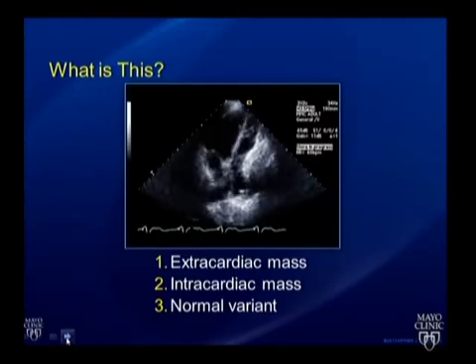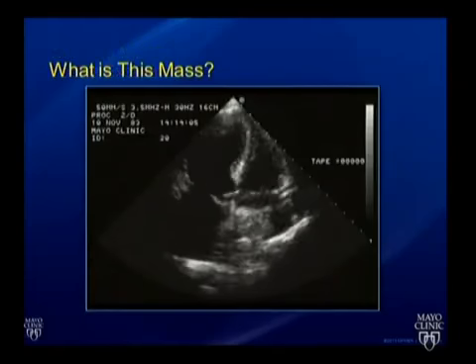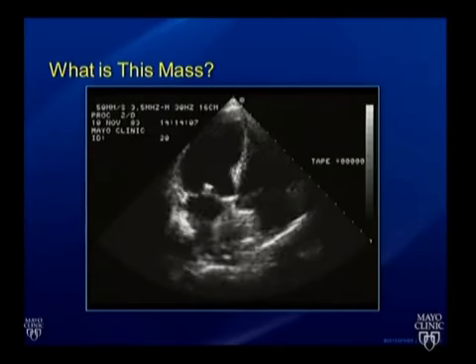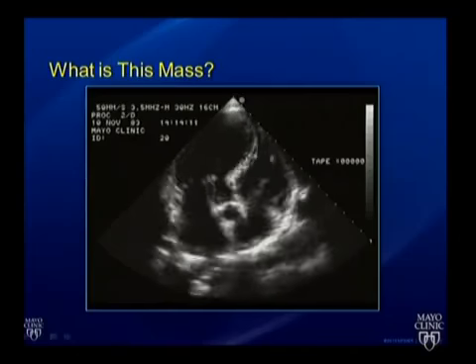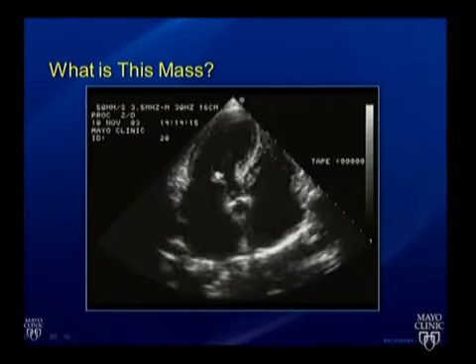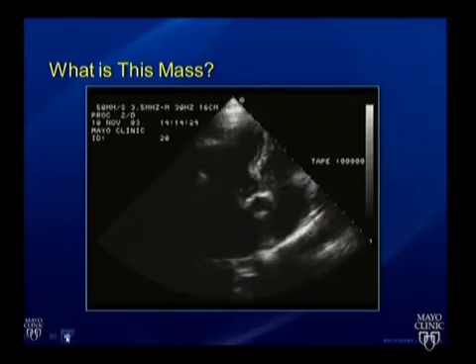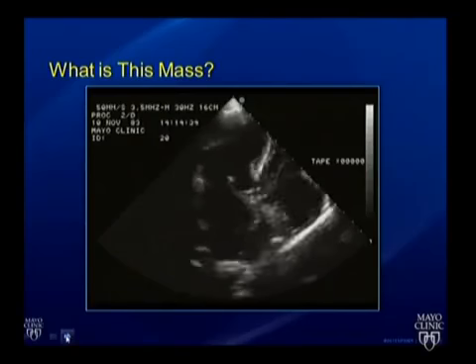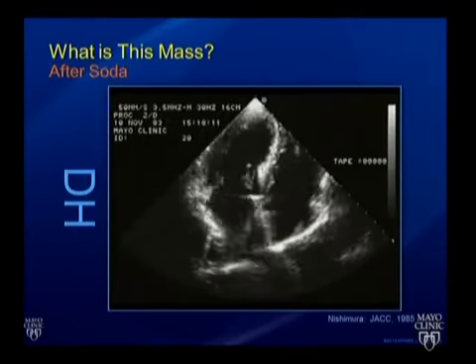So what's this? It's pectus excavatum, so it displaces the heart. Here's another potential. The sonographer here kept going back and forth. What's in this area? Well, what would you do to prove it? Okay, you guys are so good. So this is a diaphragmatic hernia.